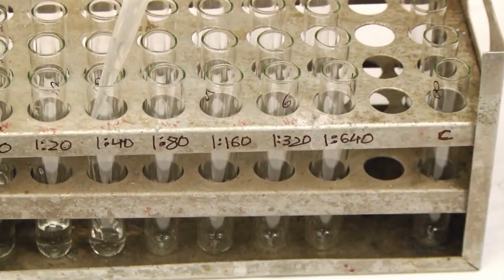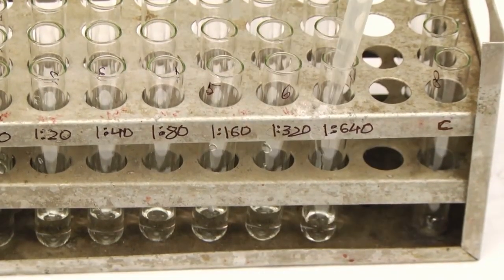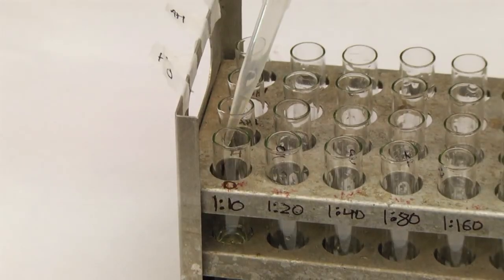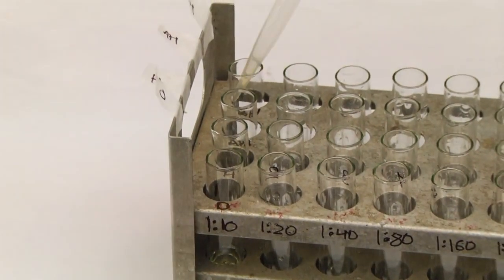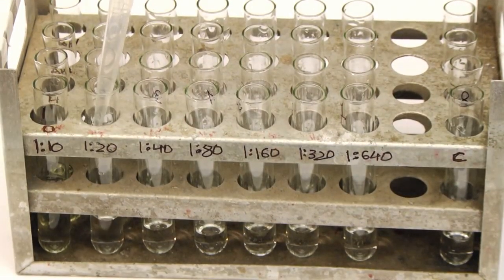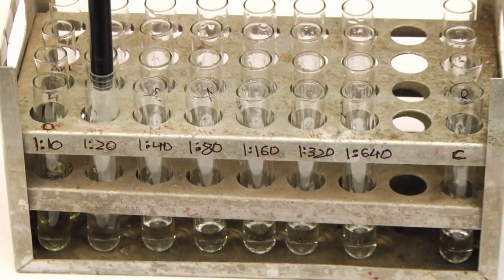To each of the remaining tubes, that is 2 to 8, add 1 milliliter of physiological saline. To tube number 1 of all sets, add 0.1 milliliters of serum sample to be tested and mix well. Transfer 1 milliliter of the diluted serum sample from tube number 1 to tube number 2 and mix well.